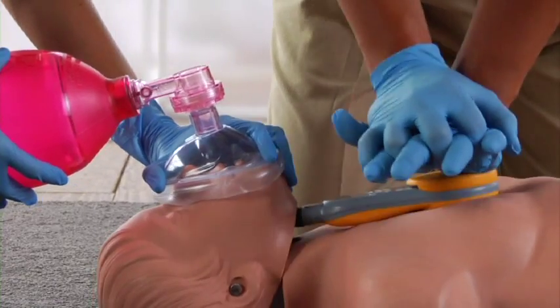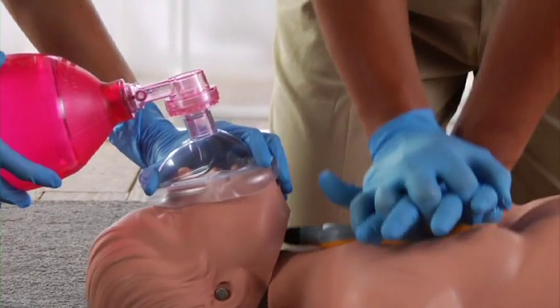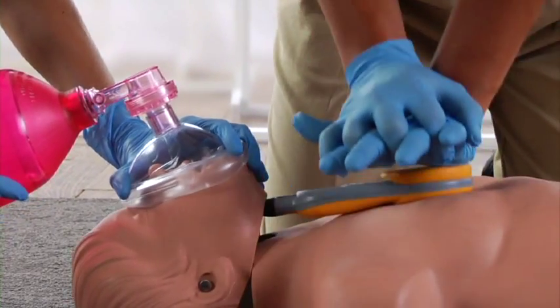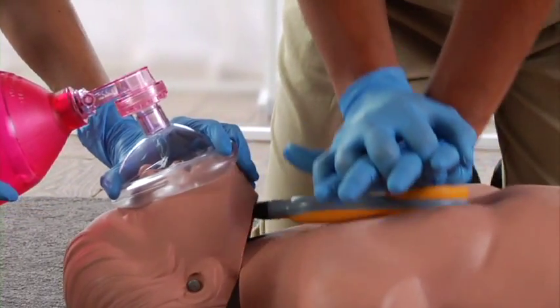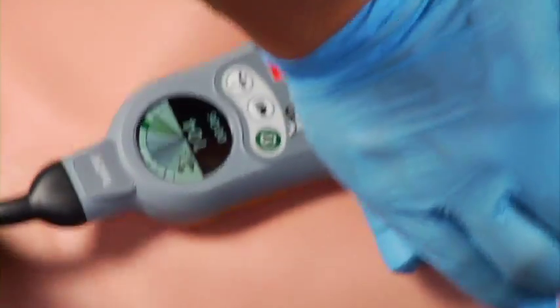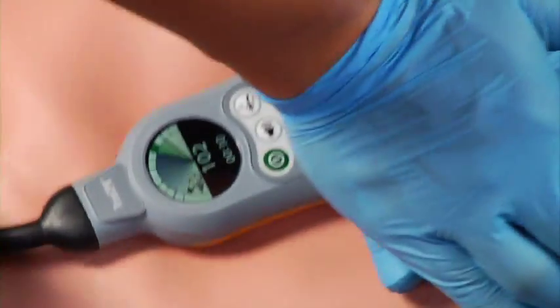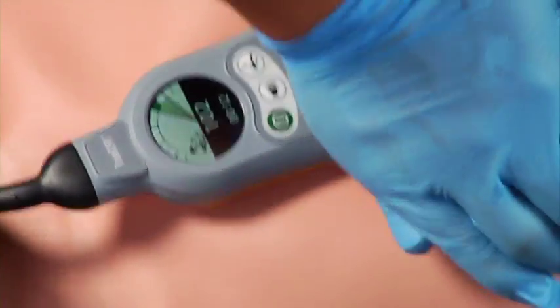Now you're up and doing compressions. Be sure to maintain proper hand position and allow the chest to fully recoil by releasing each compression completely. Listen to the metronome to time your compressions. Look at the dial display for compression depth feedback and any alerts that may appear. Adjust your technique based on feedback.